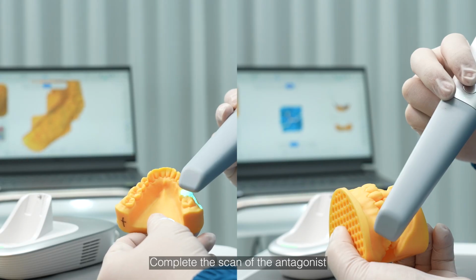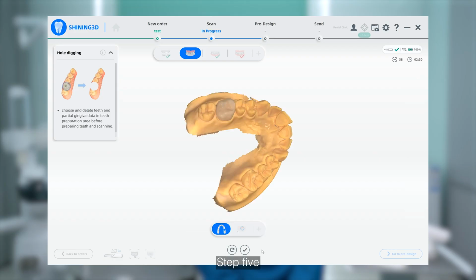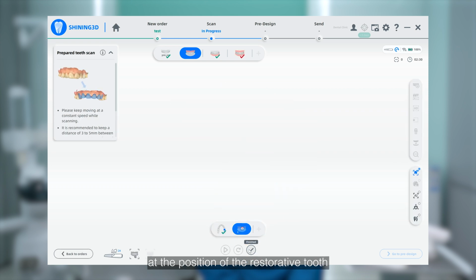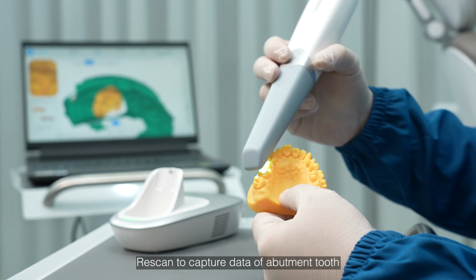Step 4. Complete the scan of the antagonist and the bite scan. Step 5. Then go back to the working arch scan process, digging a hole to remove the data at the position of the restorative tooth. Step 6. Rescan to capture data of the abutment tooth.